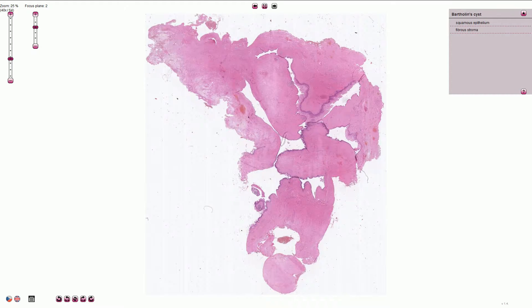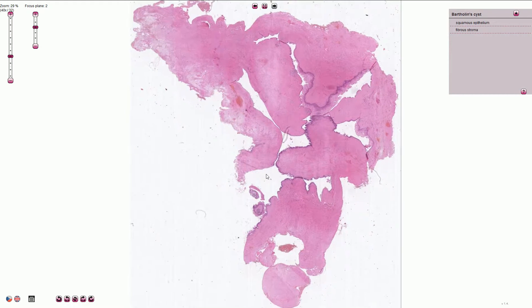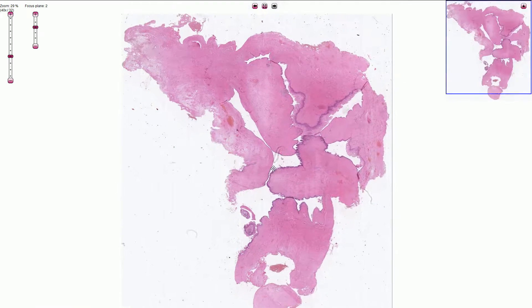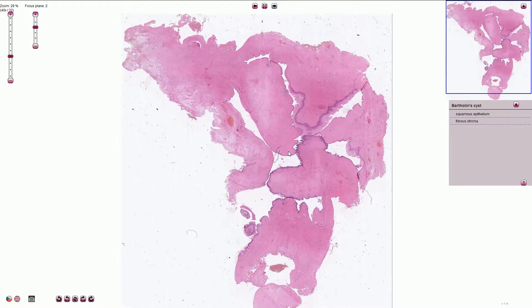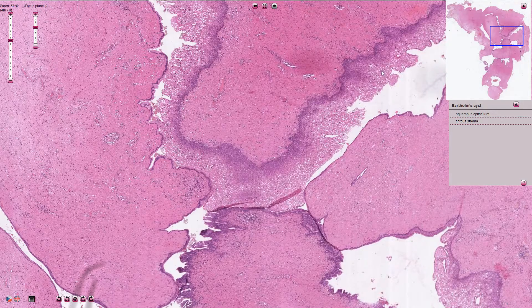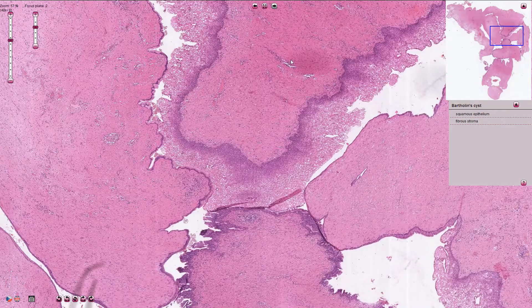The cyst is typically lined by transitional, low cuboidal, or mucinous epithelium, but sometimes we can also see stratified squamous epithelium, as in this case. Here we can see the stratified squamous epithelium with the adjacent fibrous stroma.